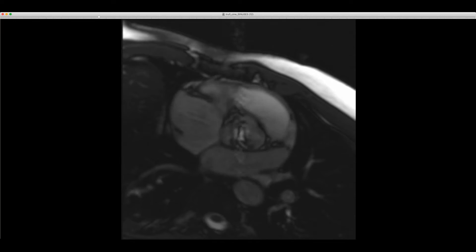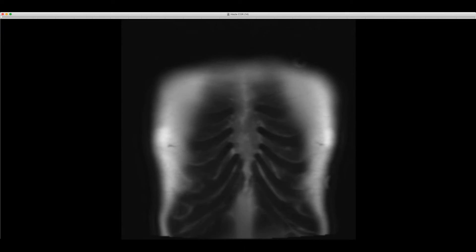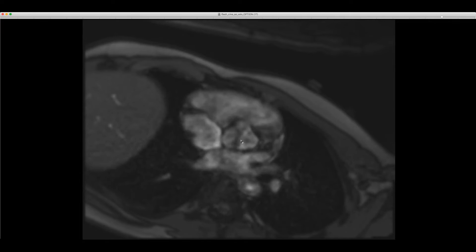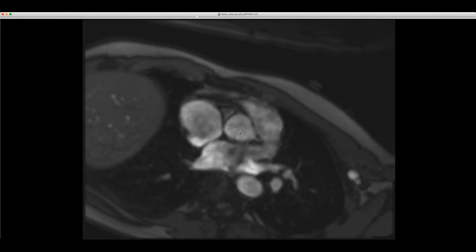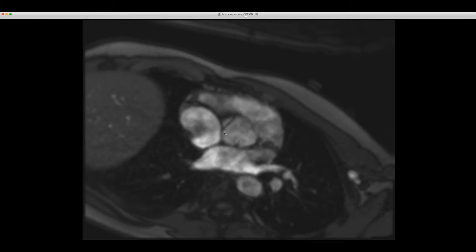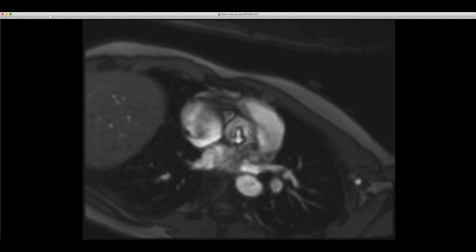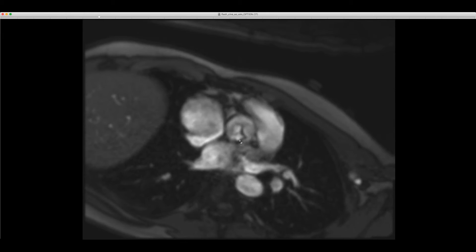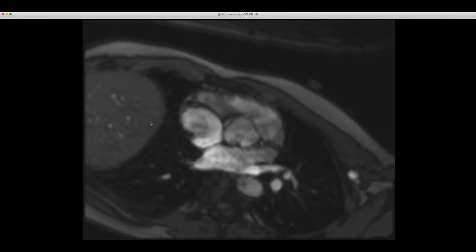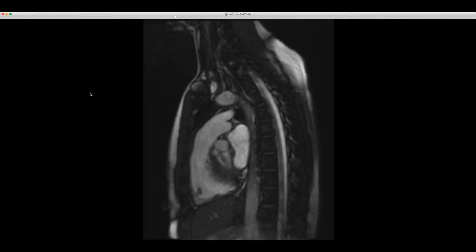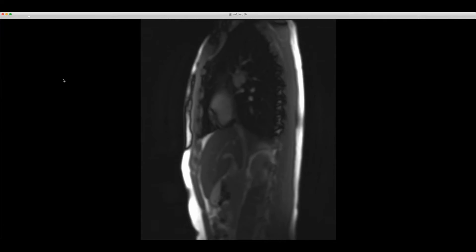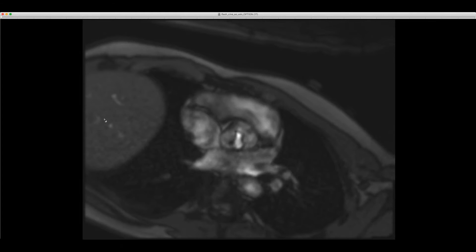Looking at cross-sections through the valve, the valve is very abnormal — you can see a small opening and two sets of fused leaflets. The right coronary leaflet and the non-coronary leaflet are fused, and there's also fusion between the right and left leaflets. In effect, this is a unicuspid aortic valve with just a single opening. Additionally, this patient has an aortic aneurysm visible on other images — an interesting case of a unicuspid aortic valve.